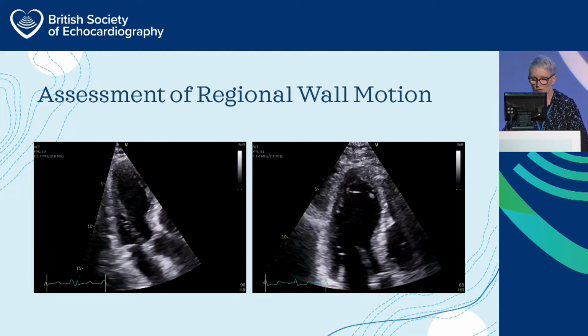And so moving on to the three-chamber view, she says, hoping that they are actually going to play. Maybe, maybe not. You might have to take my word for it, since it seems to be frozen. So basically, in this view, if it would play, let me see if we can click on it and make it play.